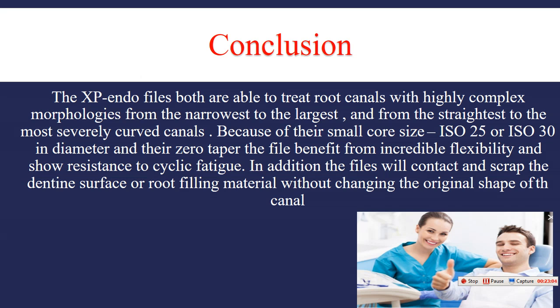because the maximum diameter is ISO 30. So it preserves the root structure as much as possible and reduces stress on the dentine wall. All these lead to successful endodontic treatment.